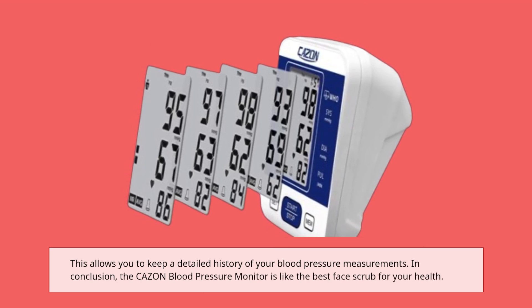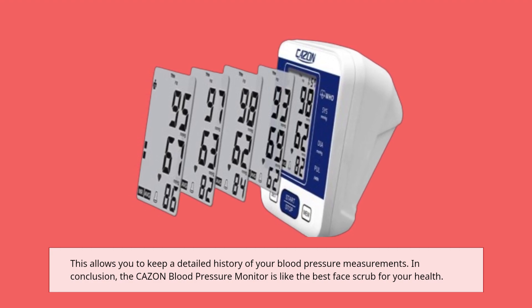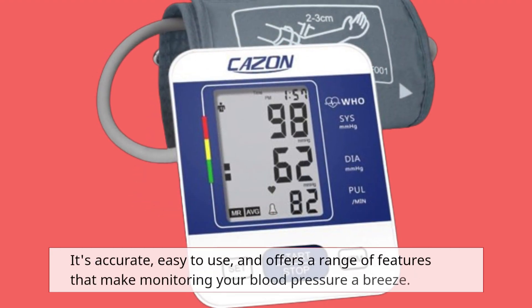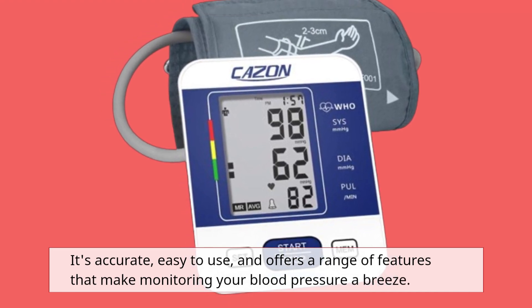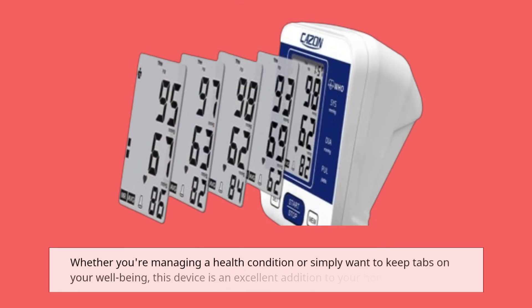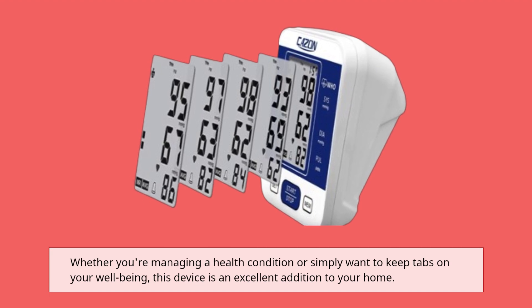In conclusion, the CAZON blood pressure monitor is like the best face scrub for your health — it's accurate, easy to use, and offers a range of features that make monitoring your blood pressure a breeze. Whether you're managing a health condition or simply want to keep tabs on your well-being, this device is an excellent addition to your home.